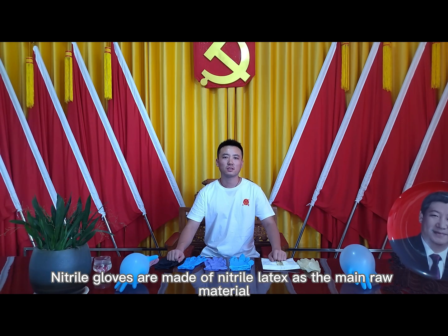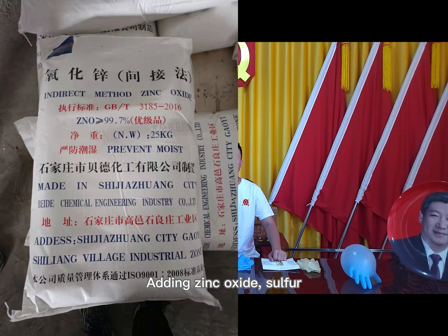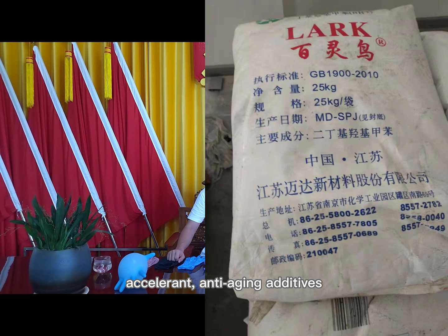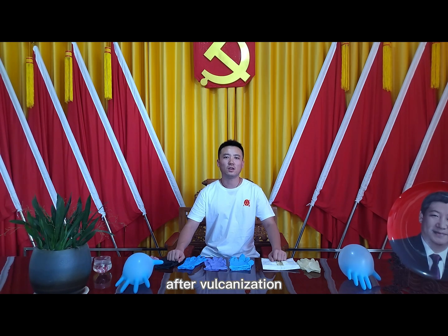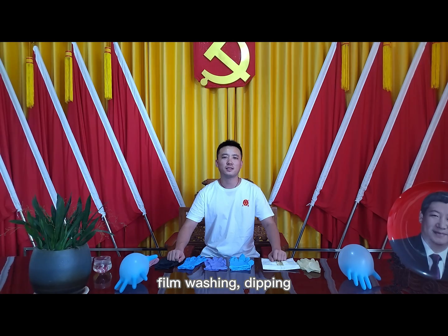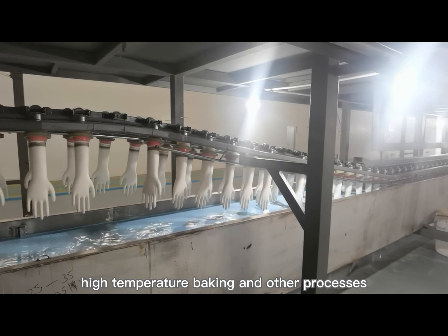What are Nitrile Gloves? Nitrile Gloves are made of nitrile latex as the main raw material, adding zinc oxide, sulfur, accelerant, and anti-aging additives. After vacuumization, film washing, dipping, and high temperature baking and other processes.